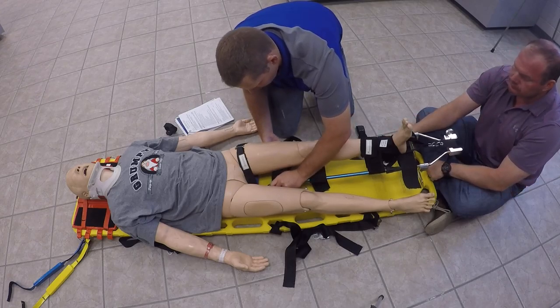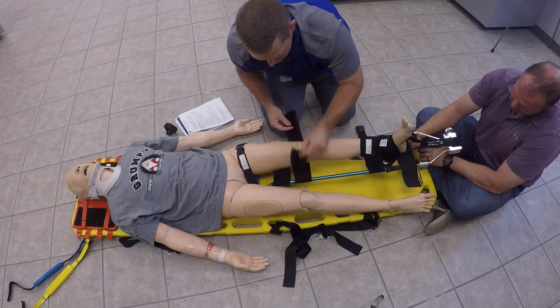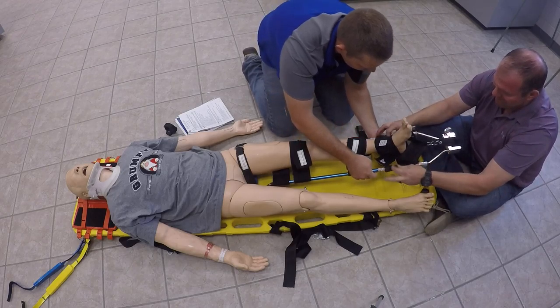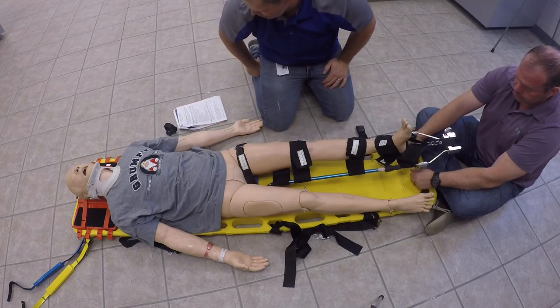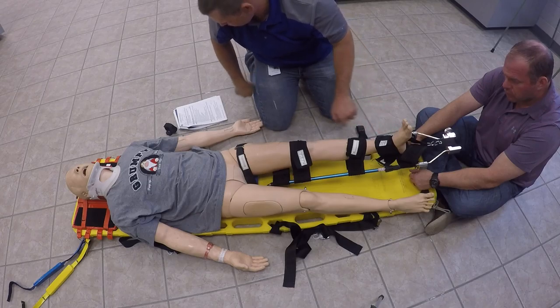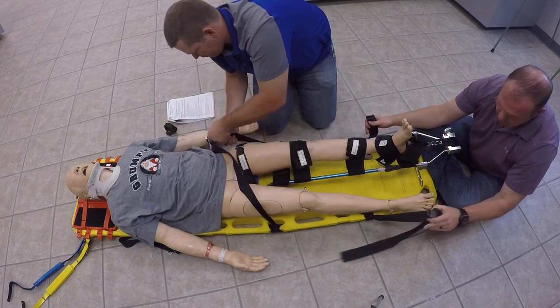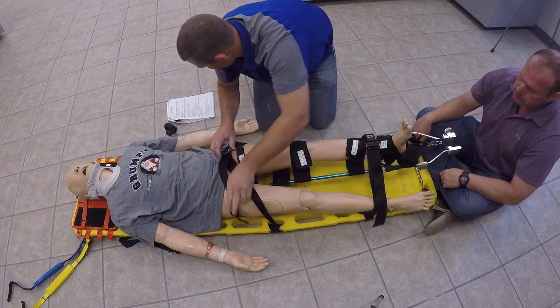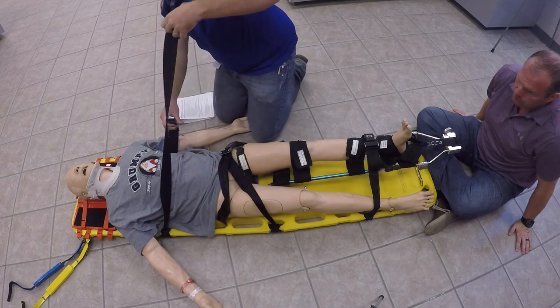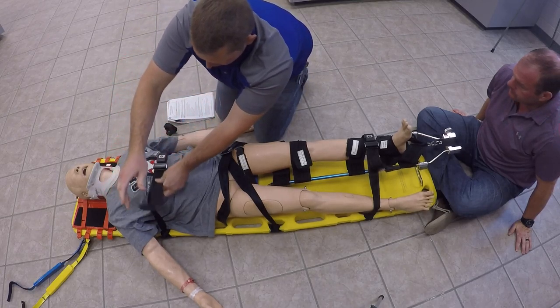Now, you don't want to actually put anything over the site of the injury if possible. Once everything's in place, you're going to go ahead and reassess PMS and make sure that it's still present. Then we'll go ahead and secure the patient to the backboard using straps, again trying not to put anything directly over the site of the injury. We want to make sure that we have secured that splint to the backboard as well so that it's not moving around at all. After any time that you move the patient, make sure that you are reassessing PMS and that it's still intact.